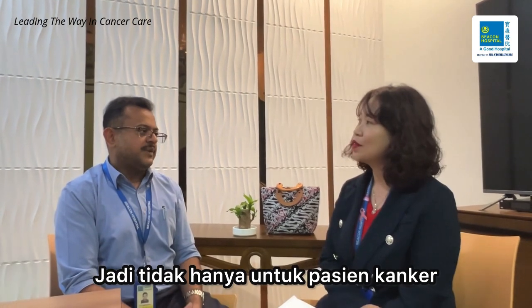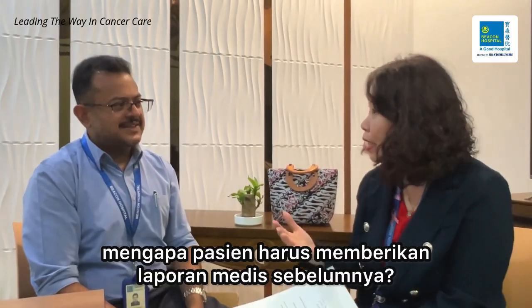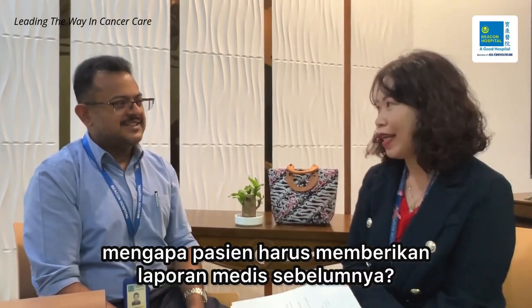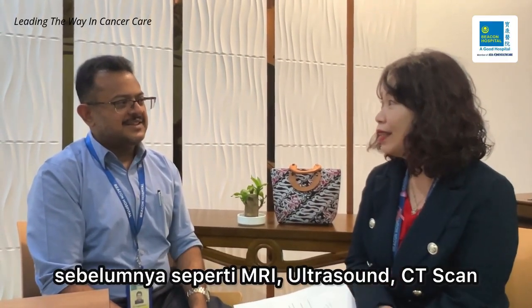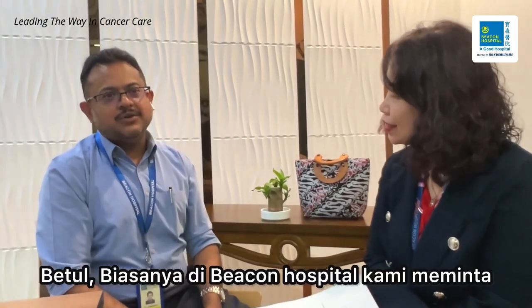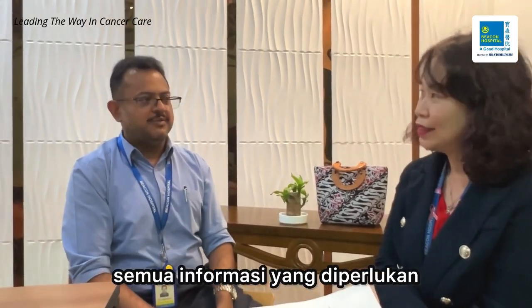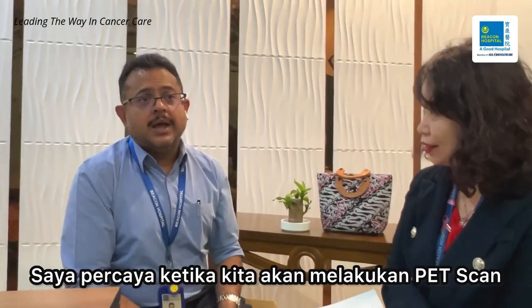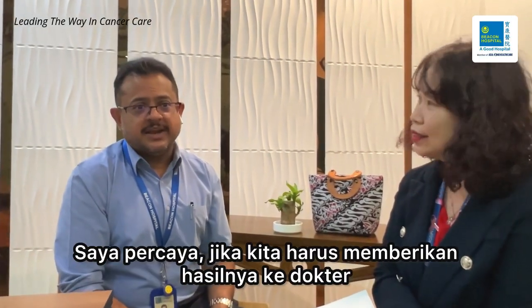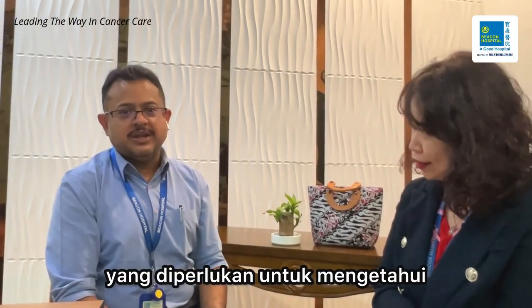I see. So not only confined to cancer patients. Yes, true. Patients have to submit their previous report like MRI, ultrasound, or CT scan. At Beacon Hospital we usually request all necessary information. Because I believe when we do the PET scan, it has to give answer to what the referring doctor needs to know.